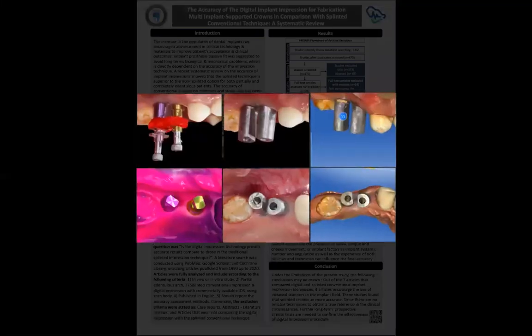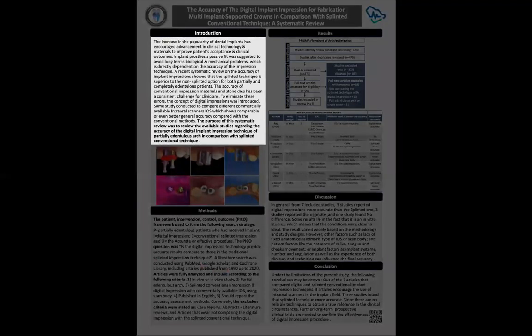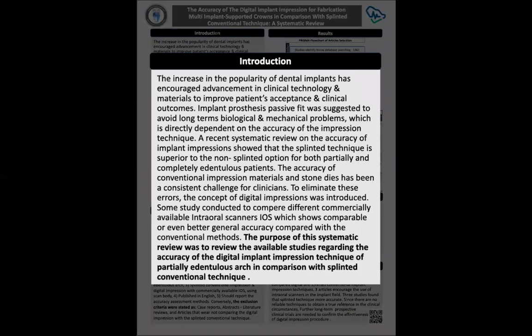If you look at the picture, this is my case. I did two impression techniques, one conventional splinted impression, and the other a digital impression using a scan body with the CEREC Omnicam intraoral scanner. The main objective in fabricating an implant-supported prosthesis is making a superstructure that reveals a passive fit to avoid long-term biological and mechanical problems, which is directly dependent on the accuracy of the impression technique.